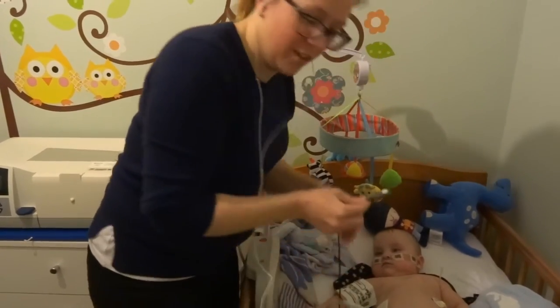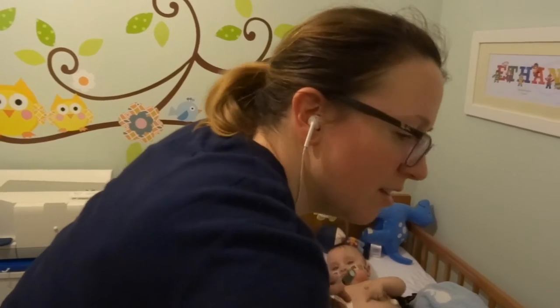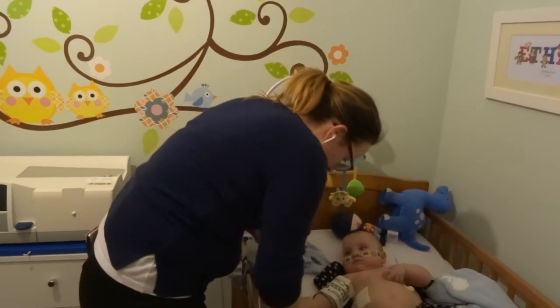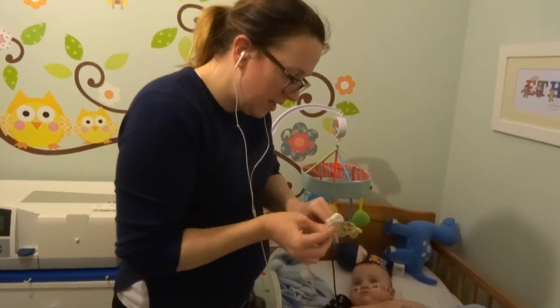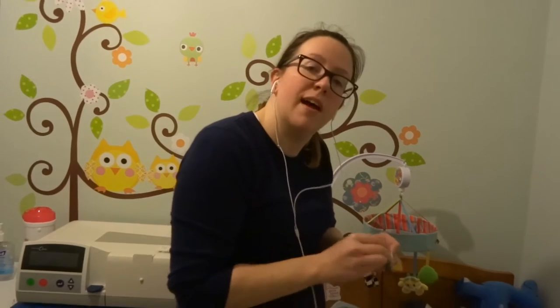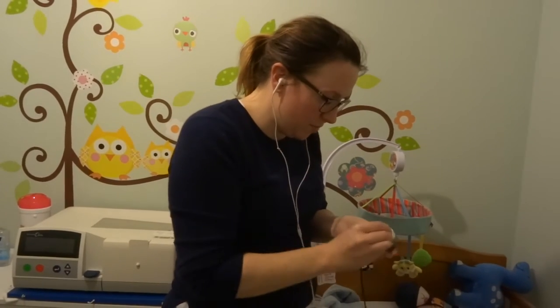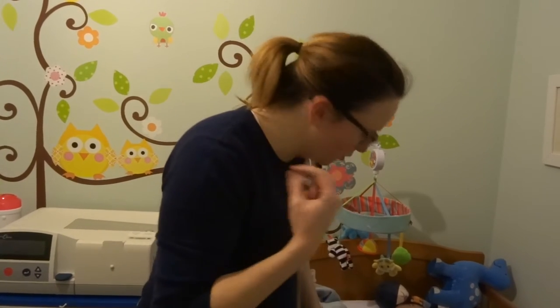Sometimes I find it right away, other times it takes a little bit longer. Just wiping the jelly off Ethan. We only need the top number of his blood pressure — the bottom one doesn't have any relevance for the dialysis. Today his top number was 78, which is quite normal for Ethan.